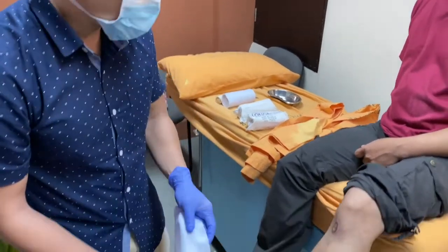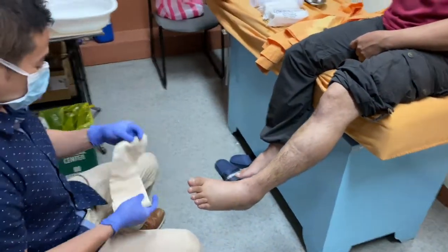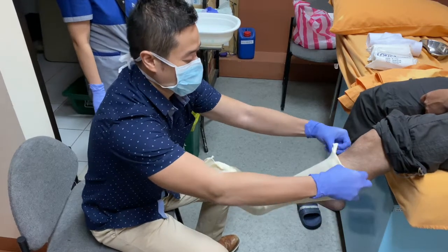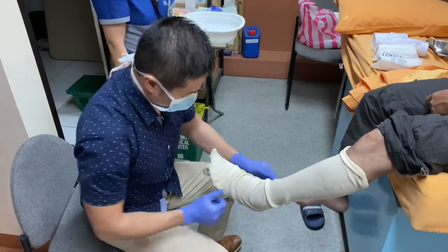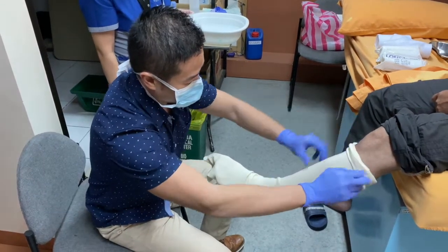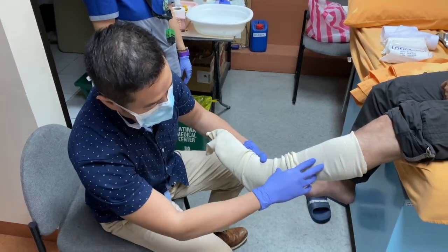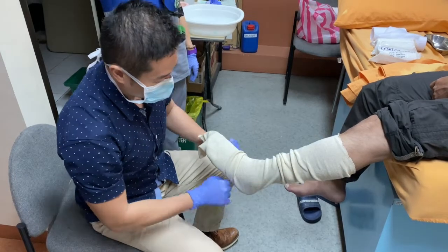First, we will measure the stockinette we will be using. The stockinette will prevent any skin irritation. The patient also has a wound from his initial injury, which we want to avoid irritating. We will allow two to three inches of stockinette from the edges of the cast. The cast will be up to the junction between the proximal third and middle third of the leg.